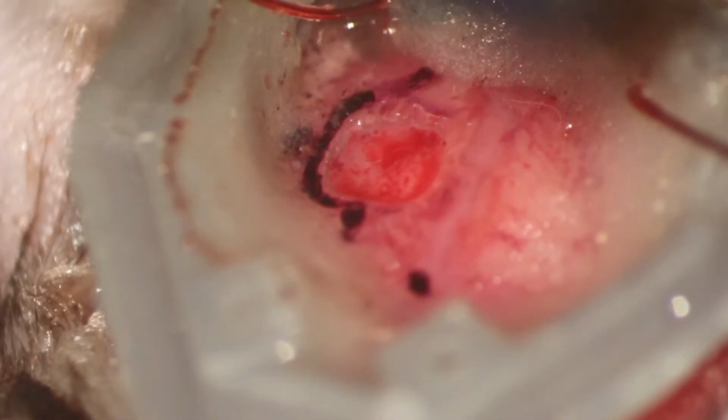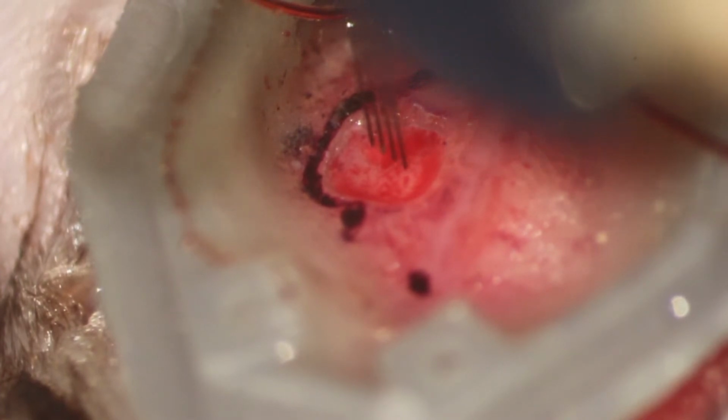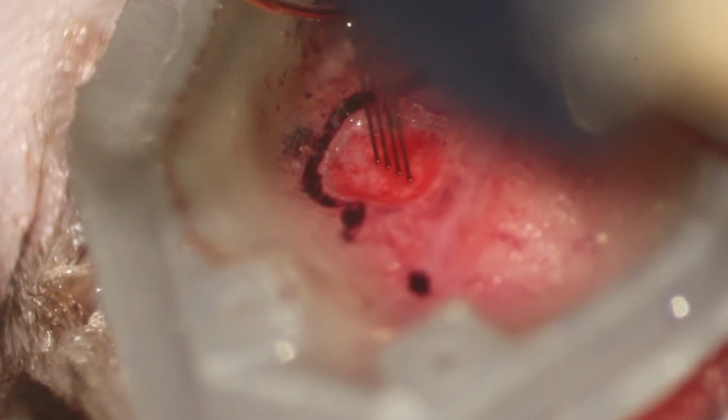And now I'm going to show you a real surgical insertion. Here you can see the exposed brain surface. You will see in a second the 4 shanks of a micro-LED optoelectrode. Once you touch the surface of the brain, you can stop there and measure the surface of the brain. Then you can move up and down until you see all 4 shanks have penetrated into the brain.